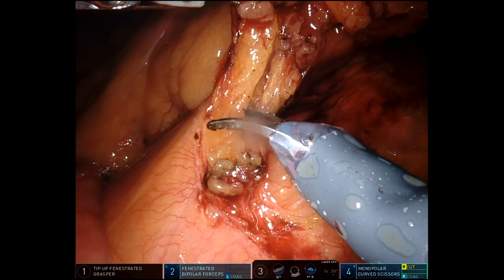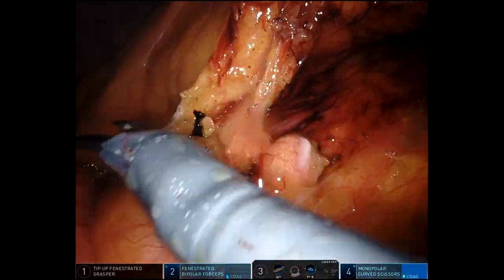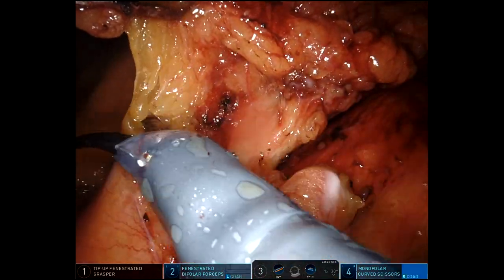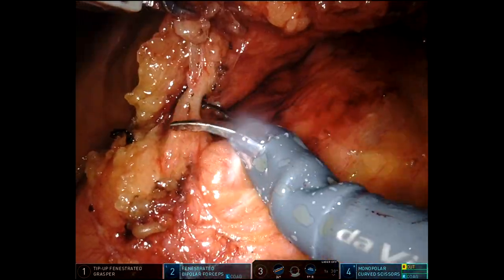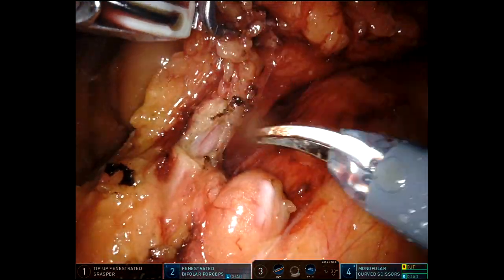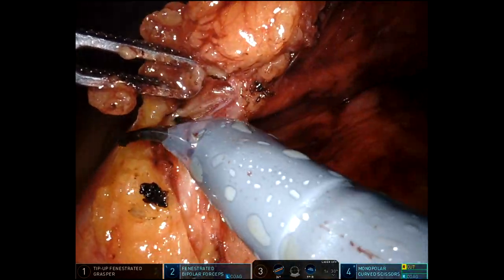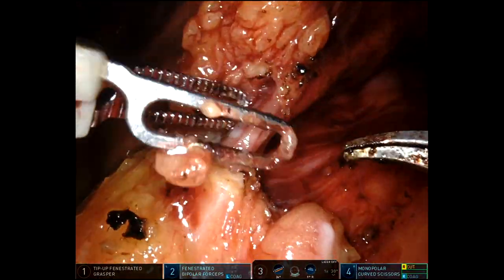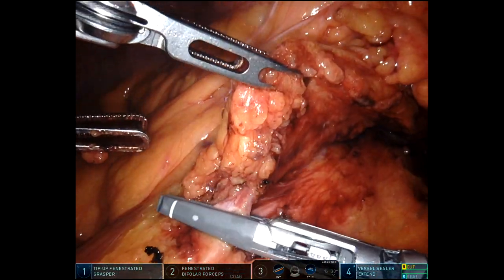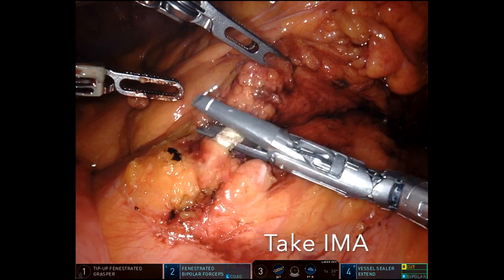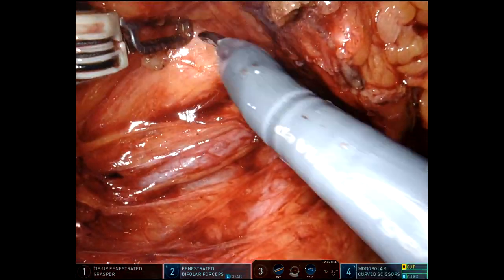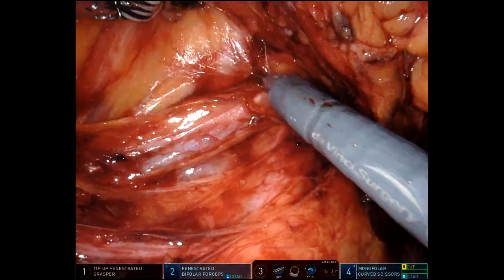It's getting really stuck there, so now I'm going to isolate the superior hemorrhoidal vessel. I like to really clean this off so that you've isolated the vessel completely — that way there's really no concern taking this with the vessel sealer without extra wads of tissue in there. Now we'll continue our medial to lateral dissection.